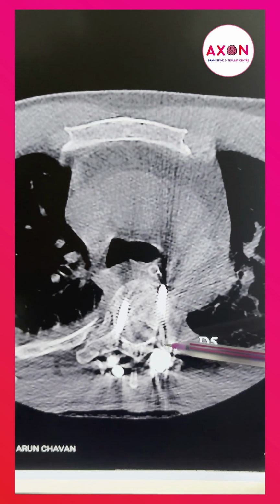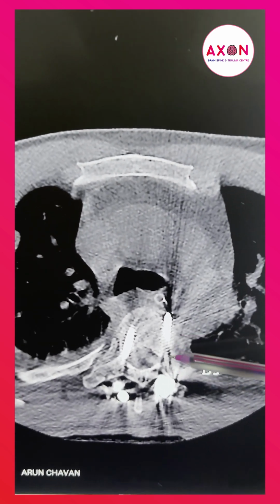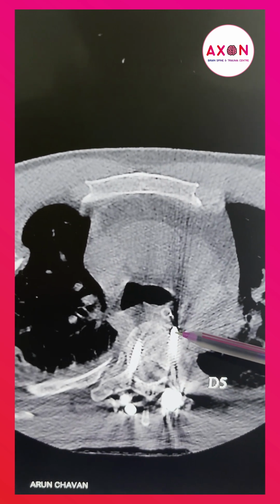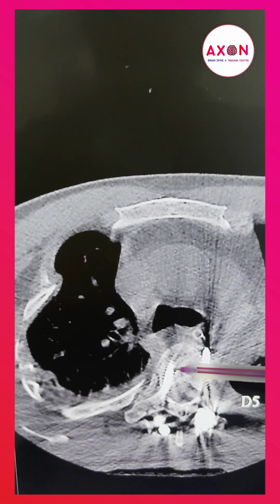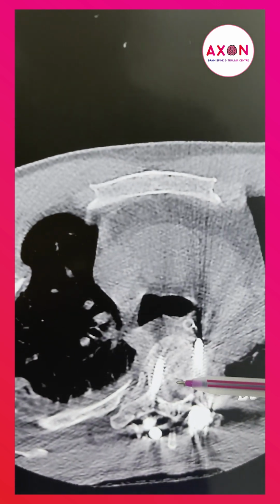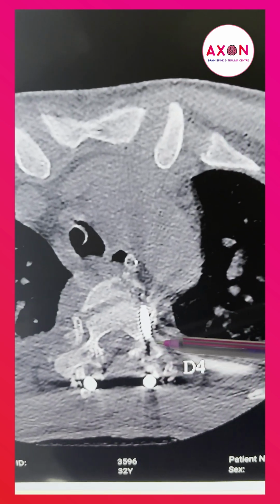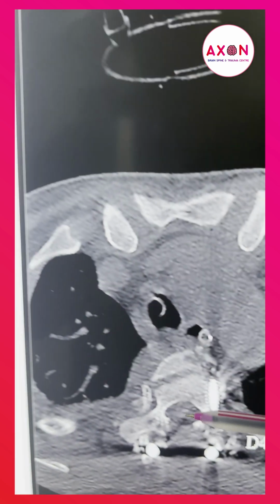You can see the D5 right side screw. This is a 3.5 mm, 35 mm screw which is going through the pedicle into the vertebral body. This left side screw is also going through the pedicle into the vertebral body. This screw placement is good. It's not touching the neural element, and it's not going too far forward. So this is the D4 right sided screw. You can see it's going through the pedicle into the fractured vertebral fragment.